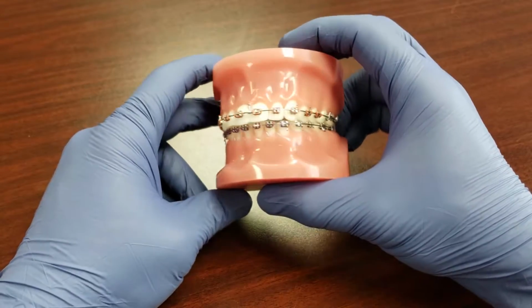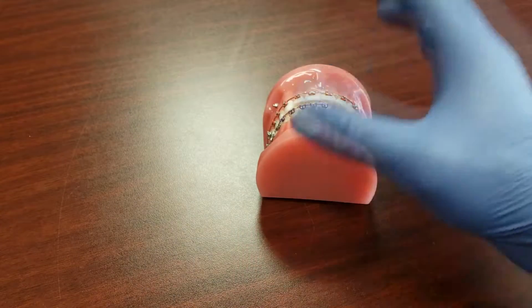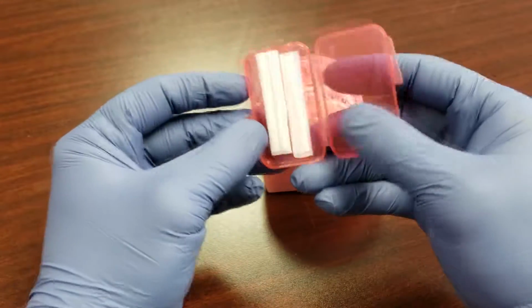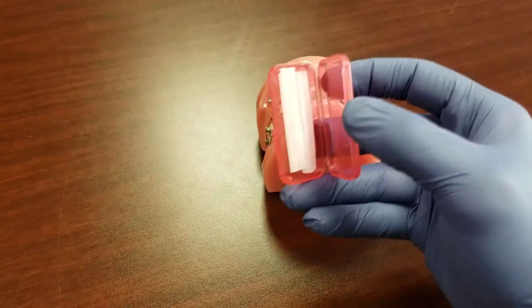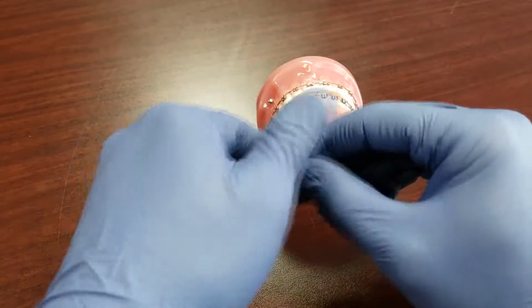So the best way to relieve that discomfort temporarily is with dental wax. Dental wax can come in many different kinds of containers. It looks something kind of like this. It comes in little strips. I've already got a little piece of it broken off right here. I'm going to show you how you can put it on those pokey spots.